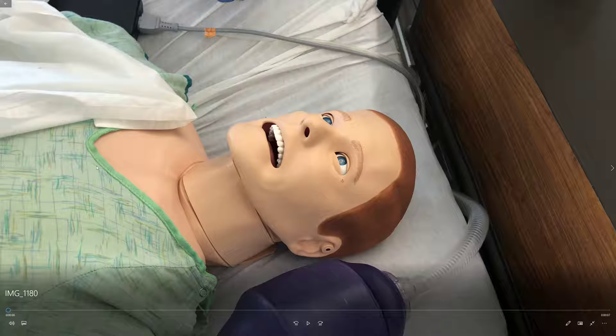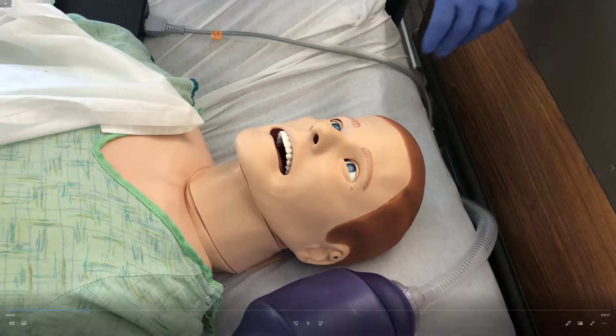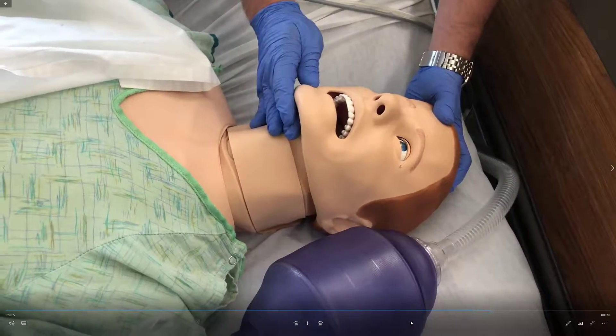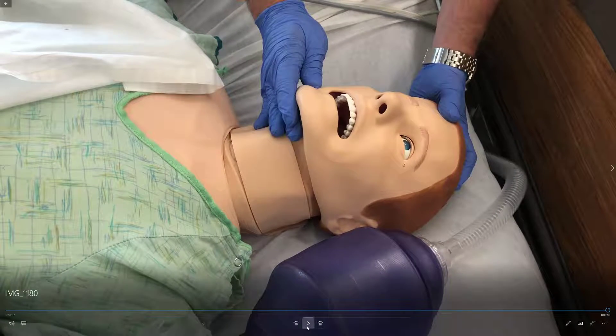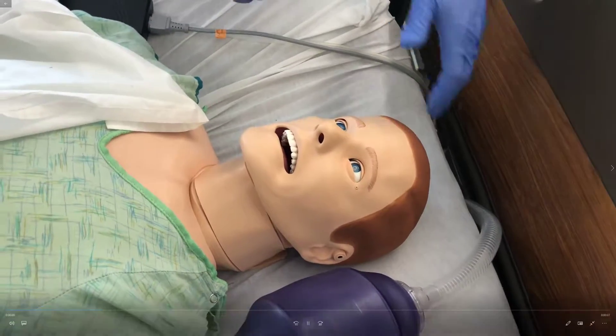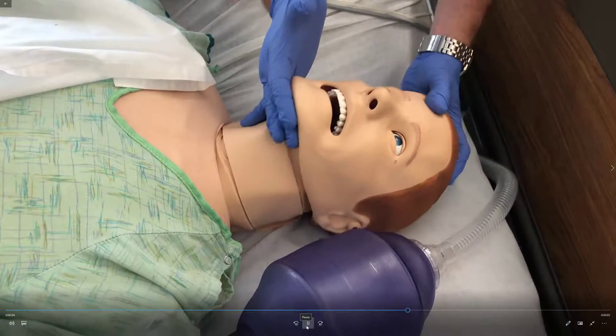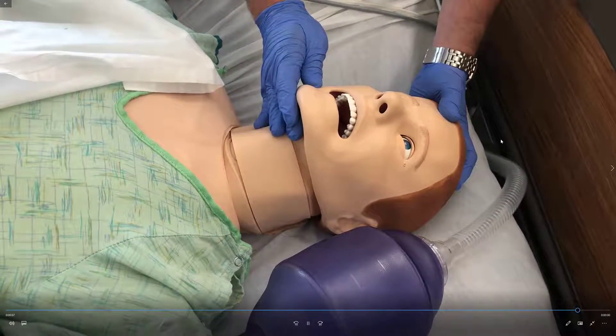First, we're going to show you how to manually open the airway. Since none of our patients are going to be trauma patients, we're going to use the head tilt chin lift maneuver. Kevin's going to demonstrate — push down gently on the top of the head while lifting up with the chin, and that'll manually open the airway. We'll watch one more time: push gently down on the head while lifting up with the chin, and that'll open the airway.